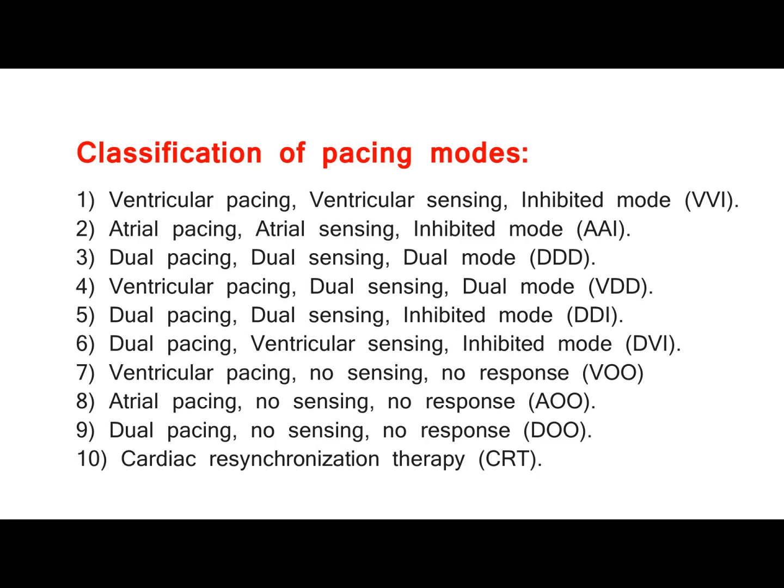5. Dual pacing, dual sensing, inhibited mode, DDI. 6. Dual pacing, ventricular sensing, inhibited mode, DVI. 7. Ventricular pacing, no sensing, no response, VOO. 8. Atrial pacing, no sensing, no response, AOO. 9. Dual pacing, no sensing, no response, DOO. 10. Cardiac resynchronization therapy, CRT.